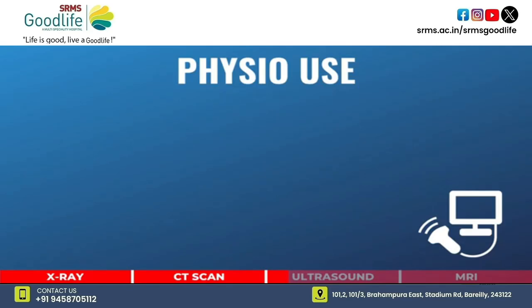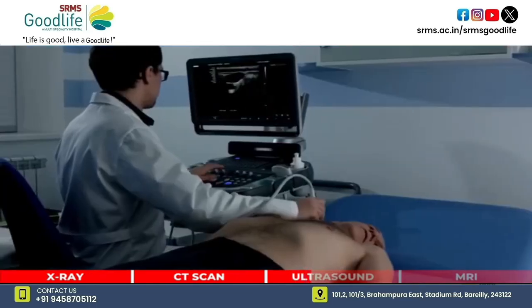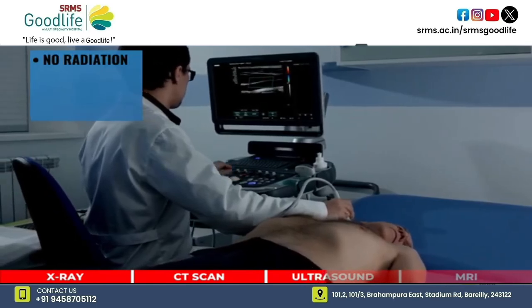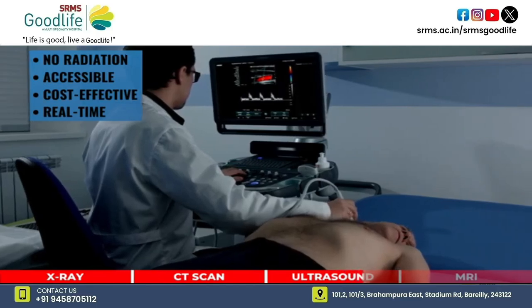Physiotherapists commonly use ultrasound to evaluate soft tissue such as the muscle, tendon, and ligament. Ultrasound has many benefits. It does not expose a person to any radiation. They're readily available, cost-effective, and most importantly, they can be performed during movement. This is particularly helpful in the evaluation of shoulder impingement.